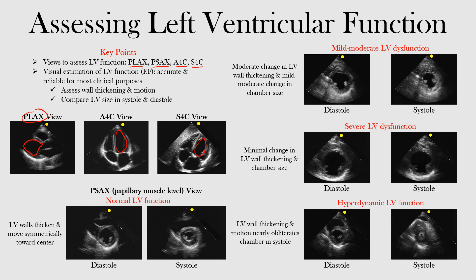Now, to assess the range from mild to moderate, severe, and even hyperdynamic LV function, we'll always want to start with normal. The views from here on will be in the parasternal short axis view, specifically at the level of the papillary muscle — the papillary muscle level parasternal short axis view. This will help us see what is normal and what is abnormal, always comparing diastole and systole.